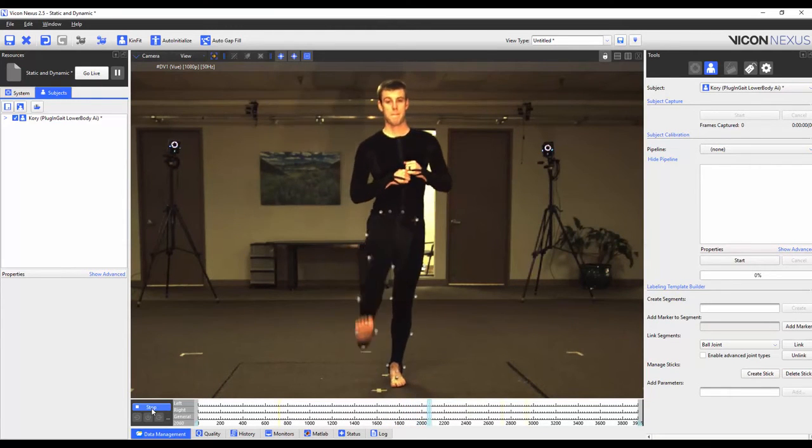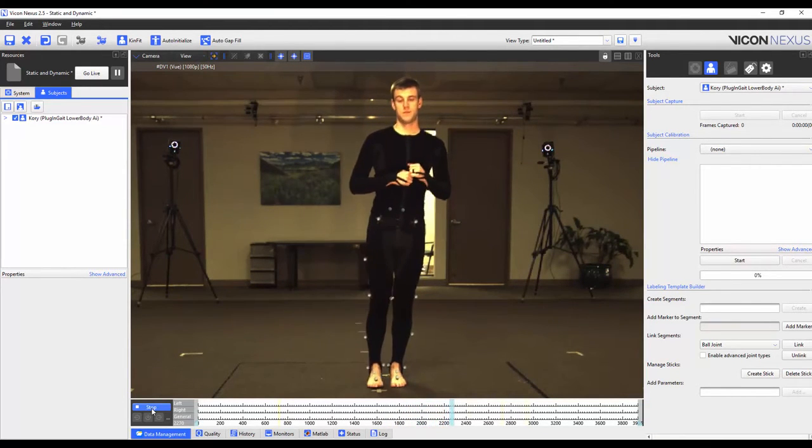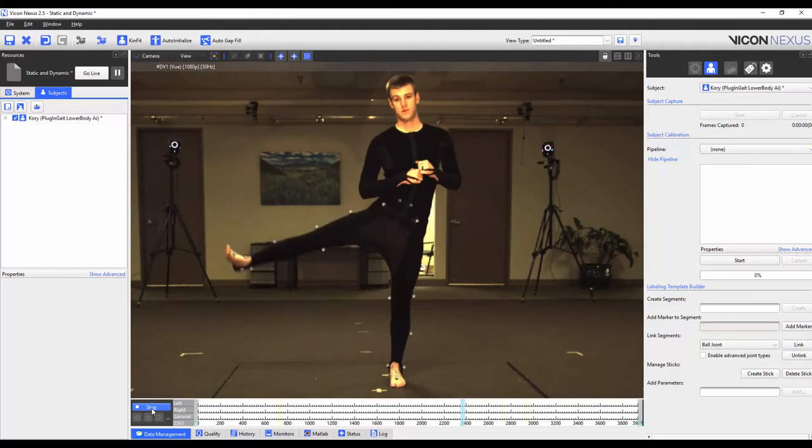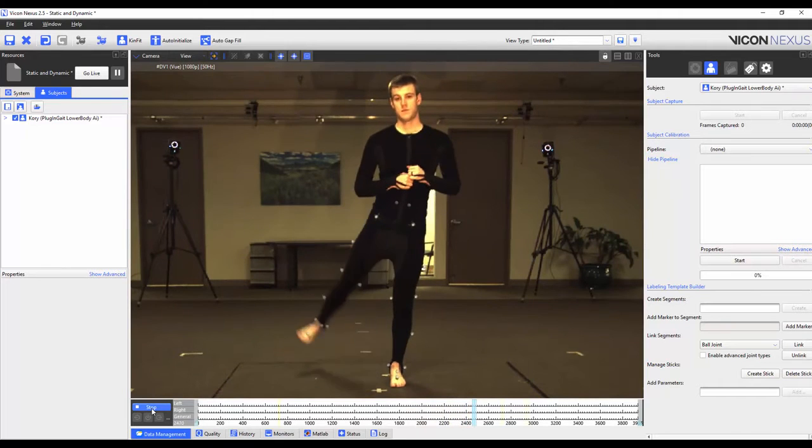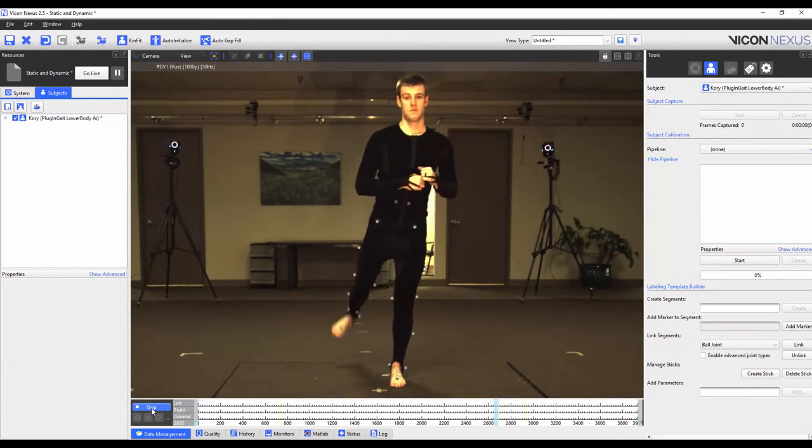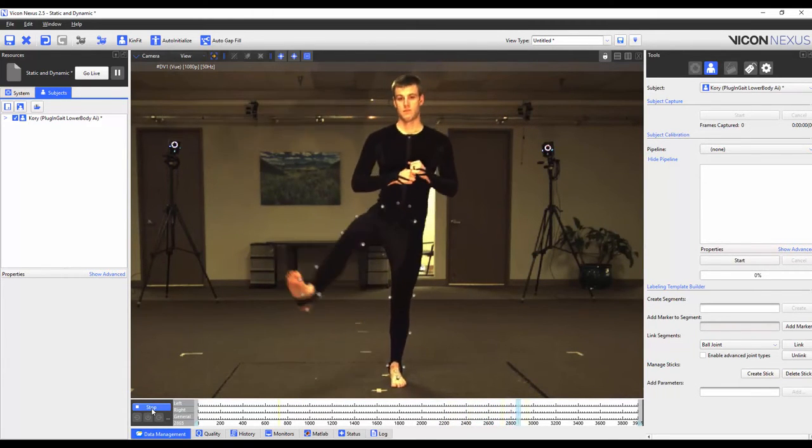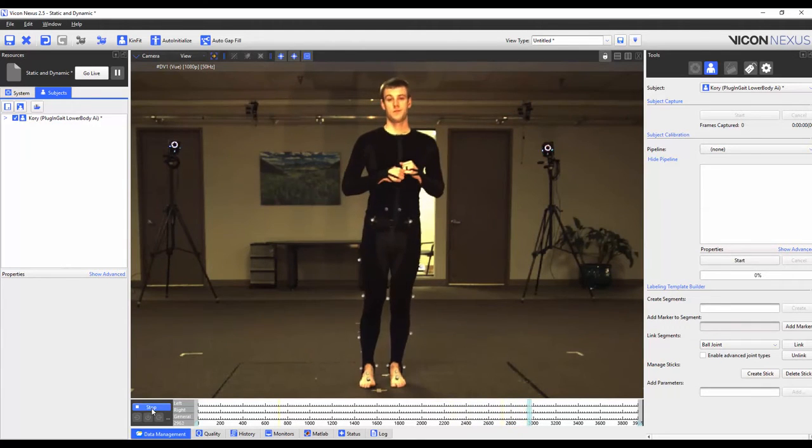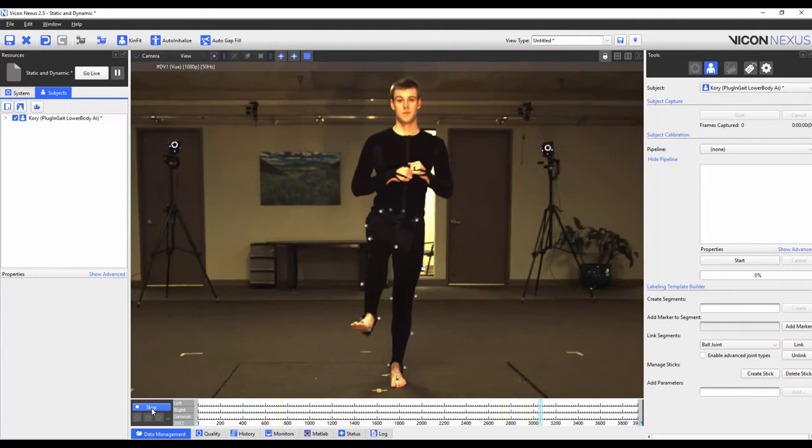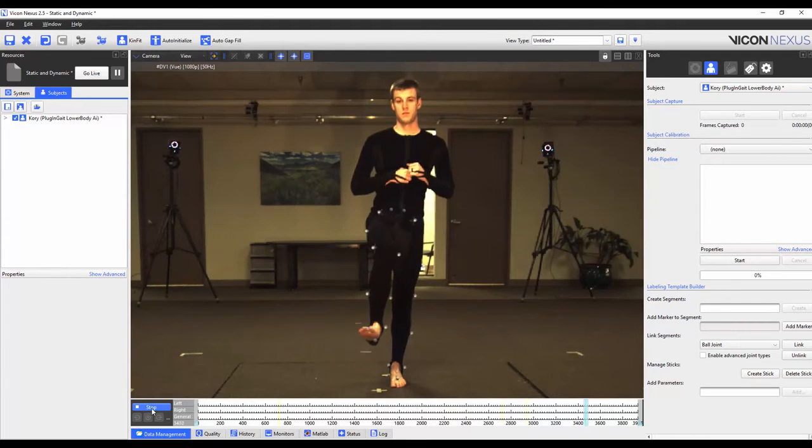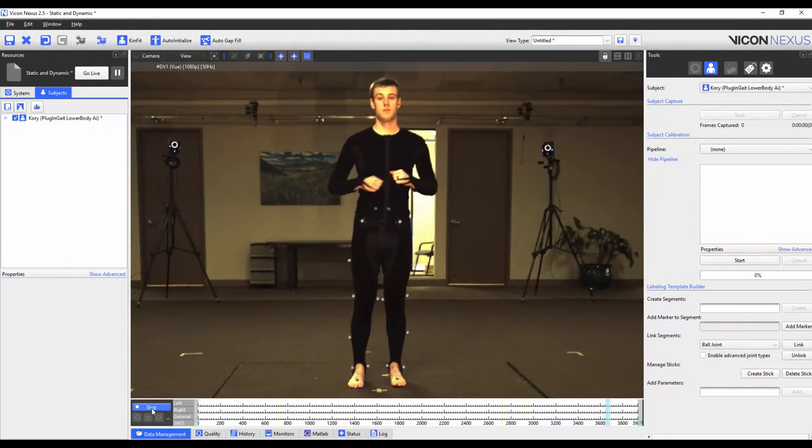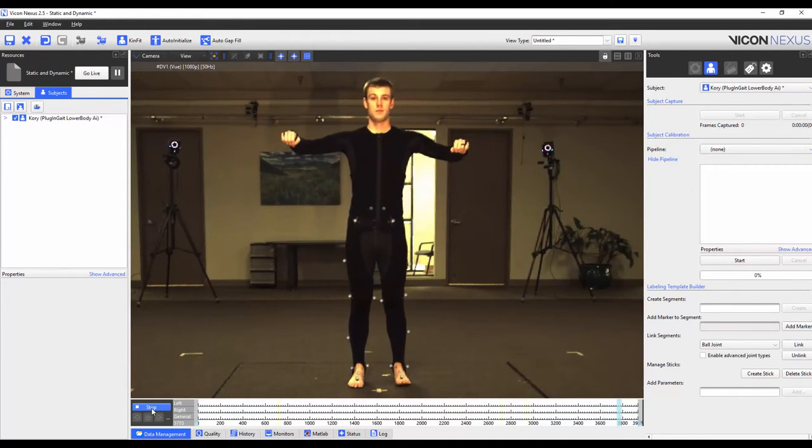The process is then repeated for the other leg. Finally the subject returns to the base pose.